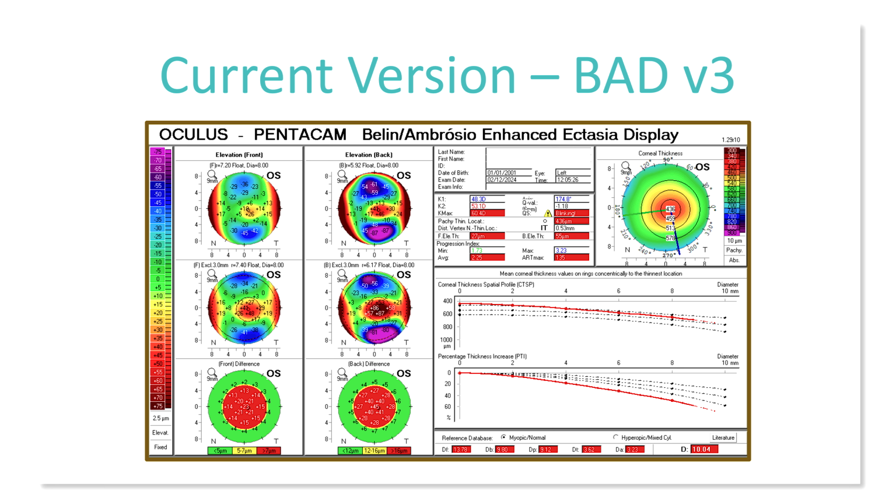The second column represents the same thing, but it's the posterior elevation. So the first one is the posterior elevation, again, against the standard 8mm optical zone. The second one is the enhanced reference surface, again, removing that exclusion zone. And the bottom one represents, again, the numerical change. You'll notice as we go to the far right, that's the pachymetric map. And if we go to the bottom right, those are the two pachymetric progression graphs.